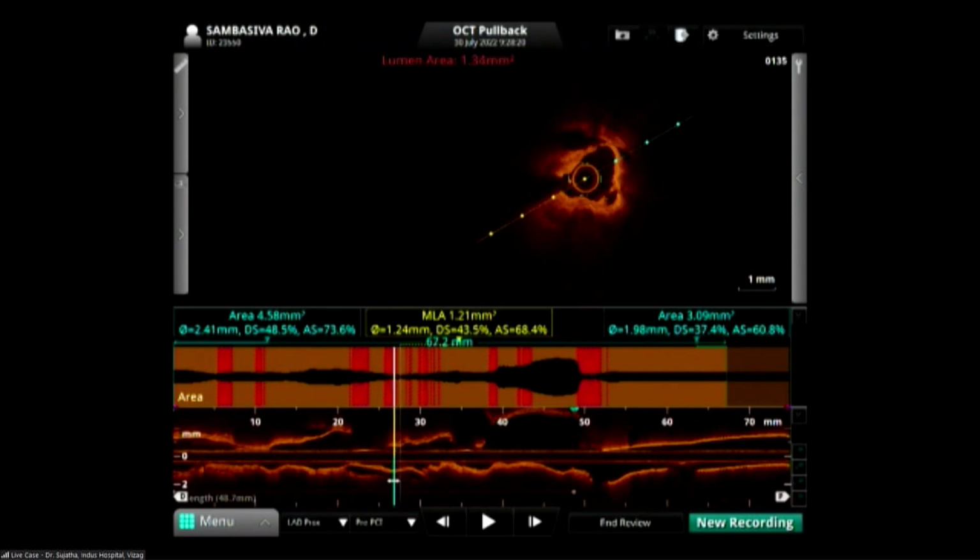That indicates that the stent underexpansion will be much higher. If you implant a stent, the stent expansion will be about 68%, whereas without this, with a calcium score of less than 4, you'll get an expansion of about 96%. So there will be a 30% difference in the stent expansion in this region. So I would still prepare it further.